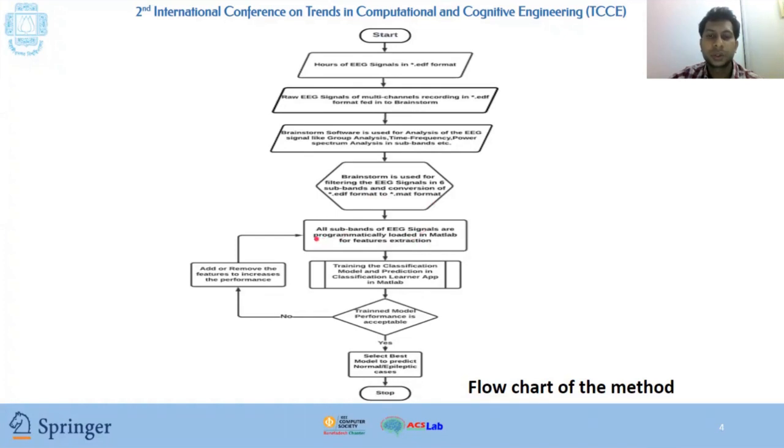The .mat files have been used by the MATLAB program, which automatically loads all of them, and from them we have extracted the features. These features were used for training the different classifier models and for prediction in the Classification Learner app in MATLAB.